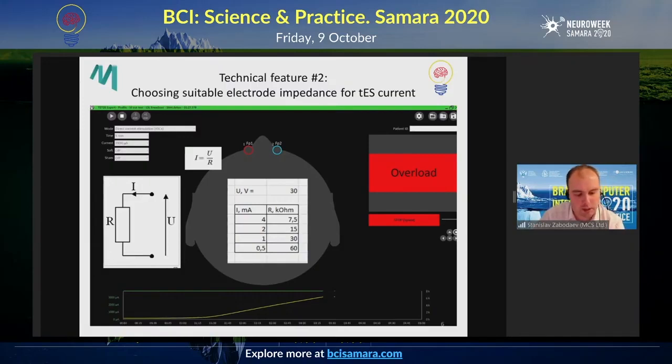And I've even heard that some people use a method to determine the maximum allowable power of the current to be used for each patient. I've heard that some researchers gradually increase the current voltage and they ask the patient to tell them when they start to feel prickling.